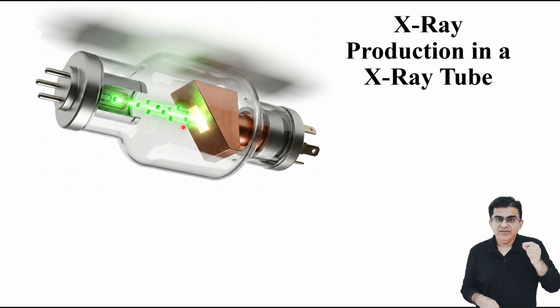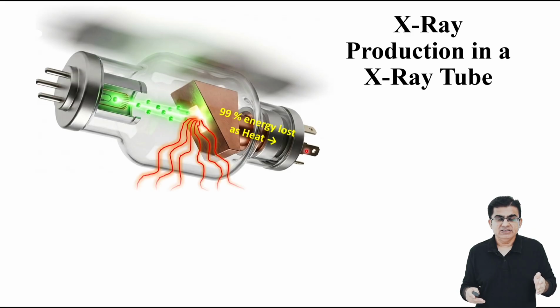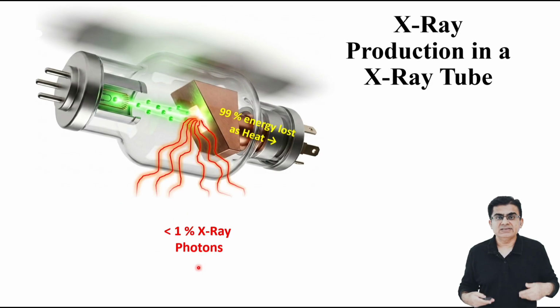We established a very important physical fact. Over 99% of the kinetic energy from this collision is converted into heat. This energy is entirely wasted. Less than 1% of the energy survives. It is only this tiny 1% X-ray which forms our clinical X-ray photons.